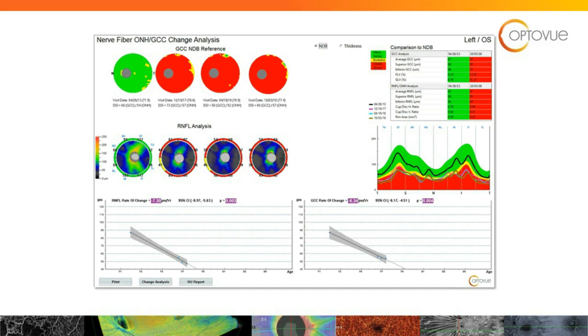But in closing, I will say that OCT continues to play an important expanding role in glaucoma management. Glaucoma is an asymmetric disease. Scrutinize the nerve fiber layer and ganglion cell complex when assessing glaucoma conversion. Use a combination of event-based and trend-based analysis to your advantage. And OCT is a useful adjunct to gonioscopy when assessing angles. And angio may become a very neat method of picking up glaucoma damage earlier.